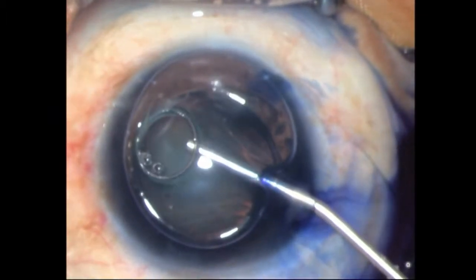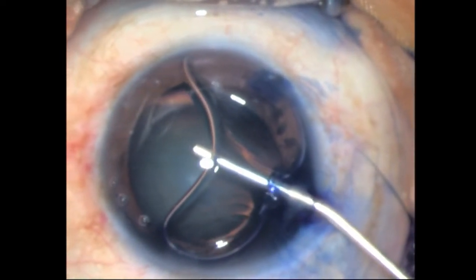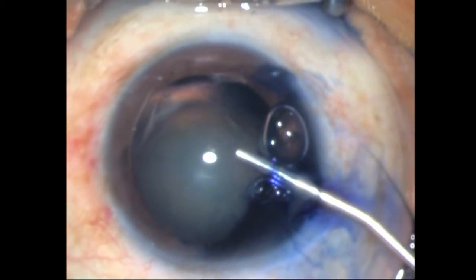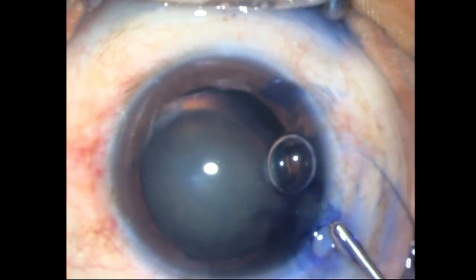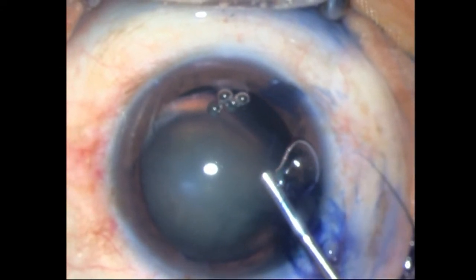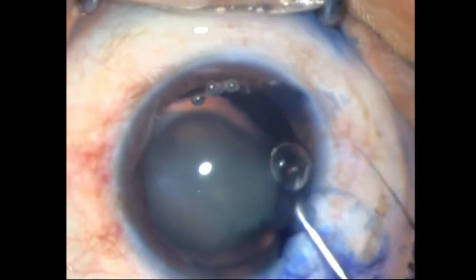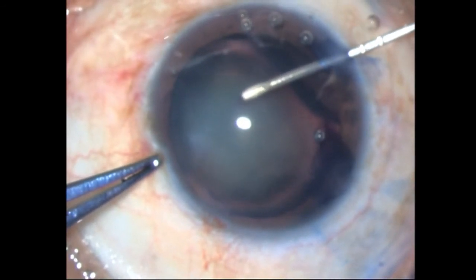After staining the capsule, I expelled both the air as well as the trypan blue with 2% HPMC, just making sure I get it all out. Once that is done, I start off my capsulorrhexis with my 26-gauge needle, with the utrata forceps ready.